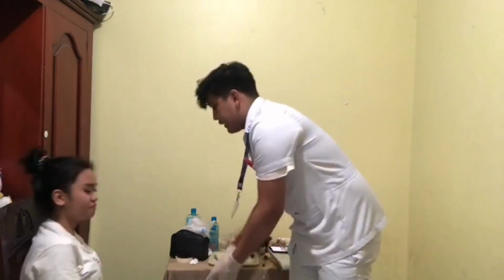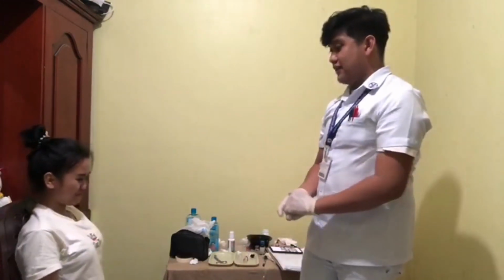Okay, so after that, we'll dispose of the materials used, and I already disposed of everything that I've used to avoid contamination. Then we'll position our client comfortably and do an aftercare. Are you okay, ma'am? Can you sit comfortably? Okay, thank you.